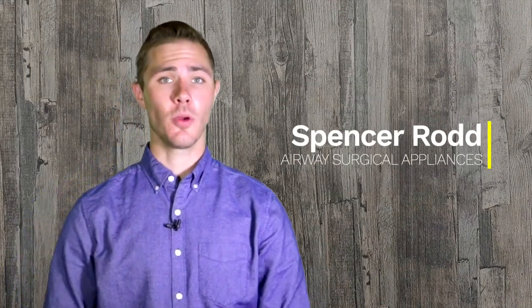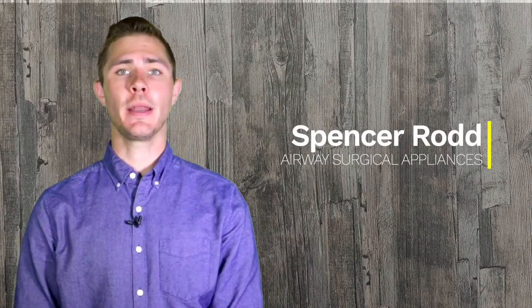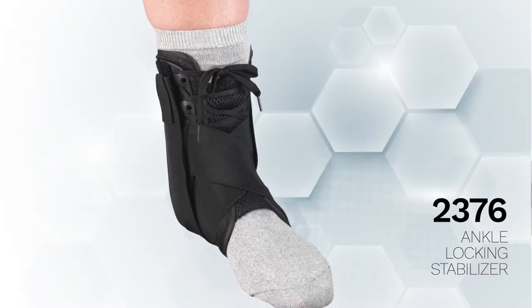Hello, my name is Spencer Rod. The purpose of this video is to show you how to properly measure and apply the OTC 2376 ankle locking stabilizer.